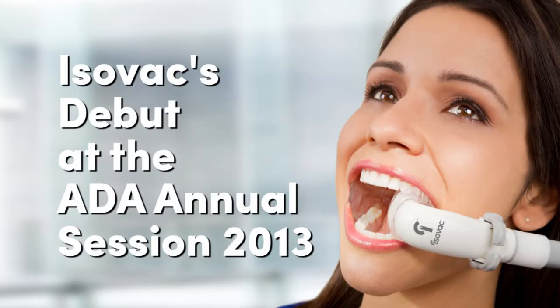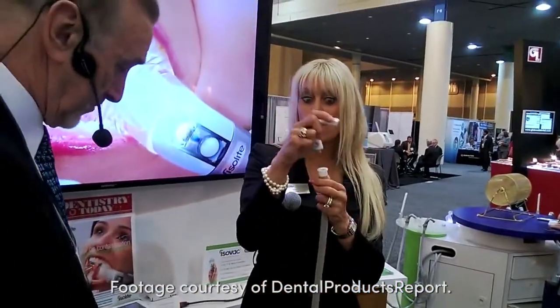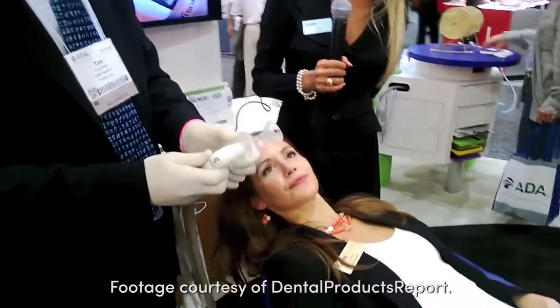We have the Isovac, which is a dental adapter that goes onto your HVE hose available in your operatory. It snaps right on — same family of mouthpieces.